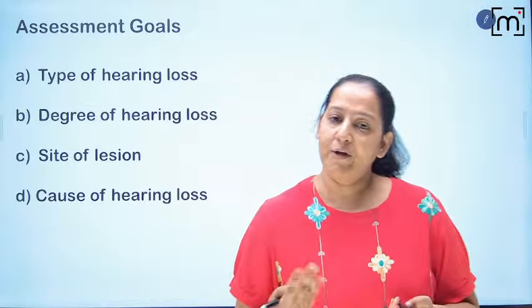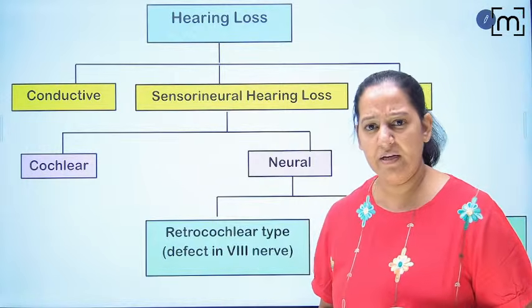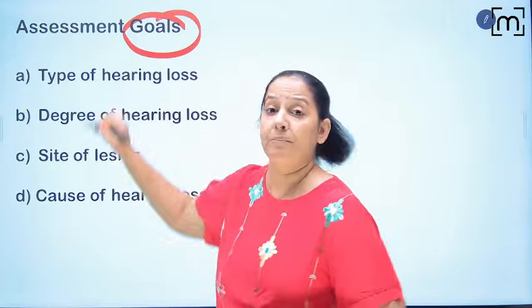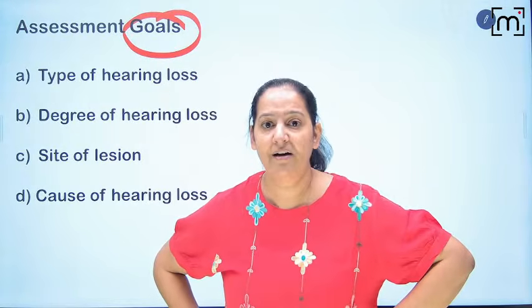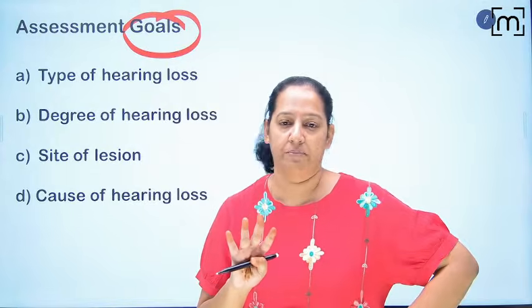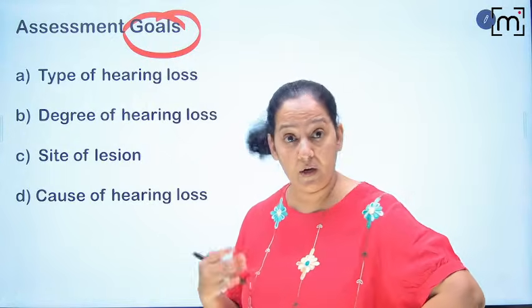So first of all, why perform a test? Is it necessary to perform a test to know the type of deafness? What is the goal? Why do you want to perform the hearing test, the assessment of hearing? We have 4 goals to perform the test. Before performing the test, you should know these goals.